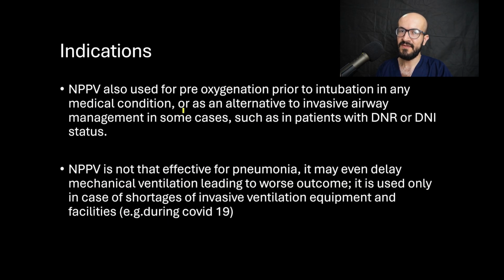Now the NPPV is also used for pre-oxygenation prior to intubation in any medical condition, or as an alternative to invasive airway management in some cases, such as in patients with do not resuscitate or do not intubate status. The NPPV is not that effective for pneumonia.